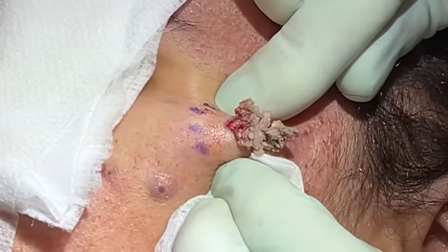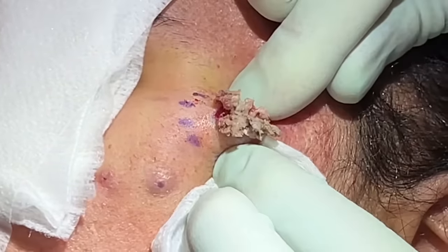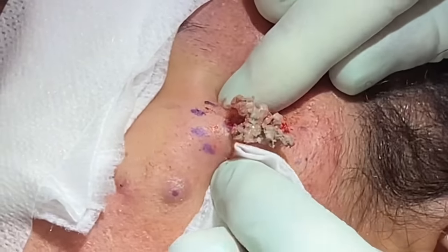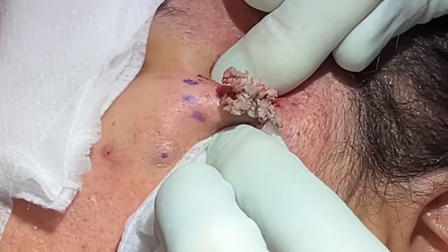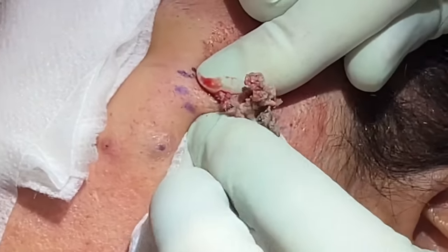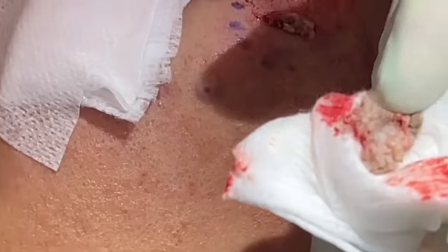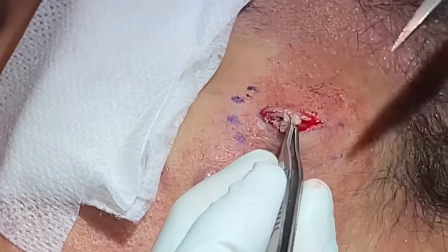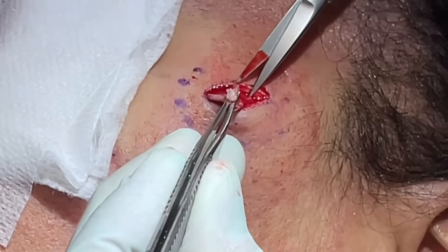You can see there are different colors — melanin-laden skin cells. African American skin will kind of have some grayish skin tone cells; that just tells us the types of cells that are there. There are a lot of skin cells in there — this one's pretty dry. Some people call these mushroom cysts because they kind of look like a mushroom when they come out. That's good dry cyst contents. Now that has shrunk the sac and we can just lift up, start undermining, walk these back, and pop this out.